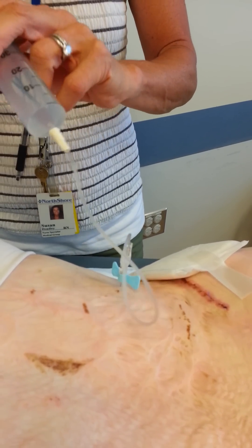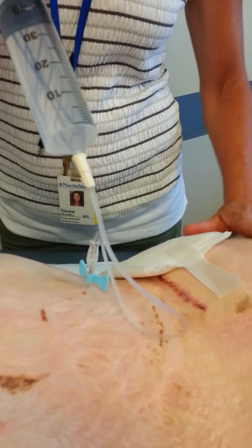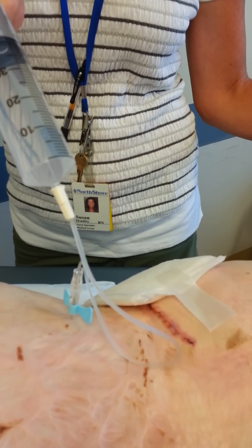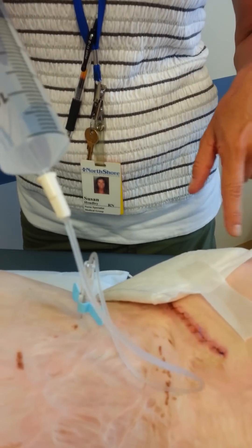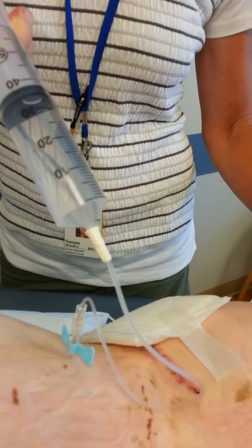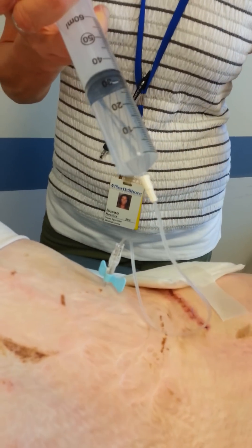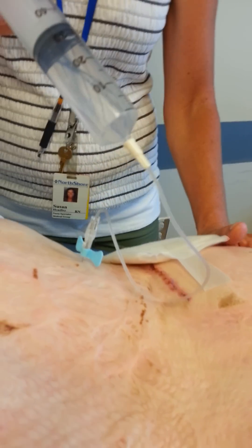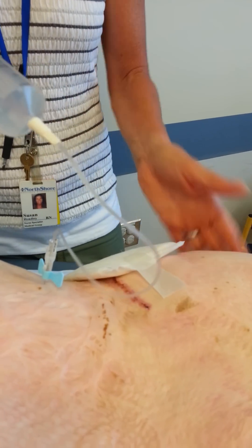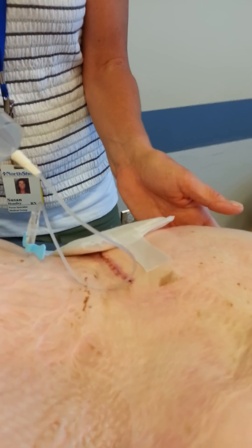One thing — what you look at when you're starting to fill these expanders is how is it feeling, how firm does it feel. You look at the capillary refill, which means you press, count 1,000... 2,000... the color's already back. If you get to 3,000, 4,000, 5,000 and it's still not coming back, that means there's too much in there. You want that capillary return to be within three seconds so that you're not putting too much compression on the vessels surrounding this expander.